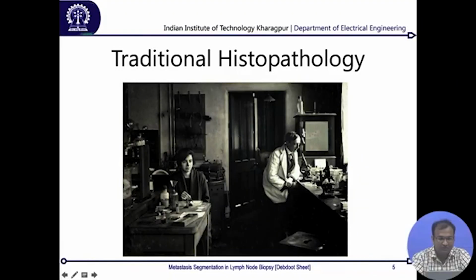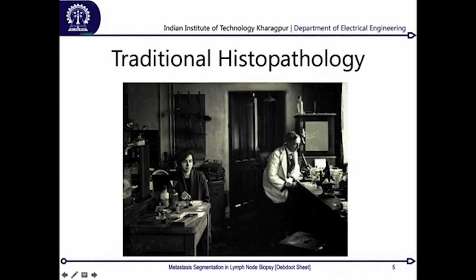In the old technique, a doctor pulls out the mass of tissue, and a technician prepares it into slides. As we learnt on the microscopy side, you have to do some processing for that, and we also saw histology slides for oral biopsies. Over here you will have similar slides prepared for lymph node biopsies.